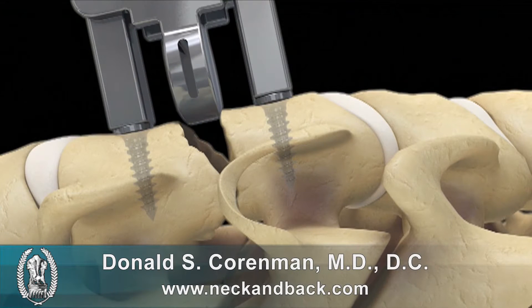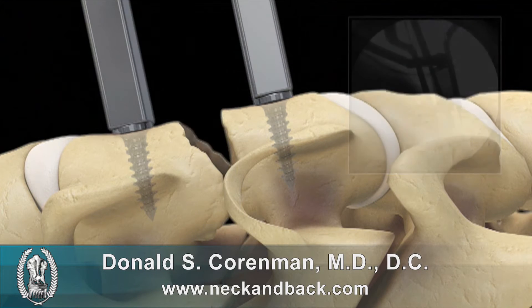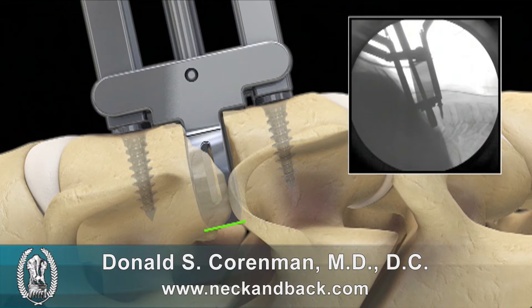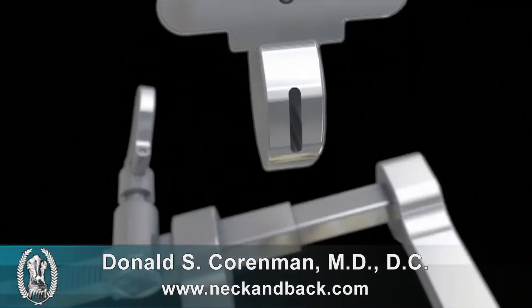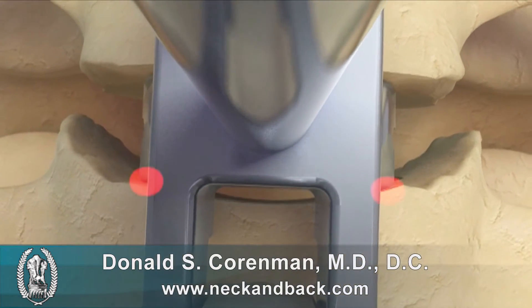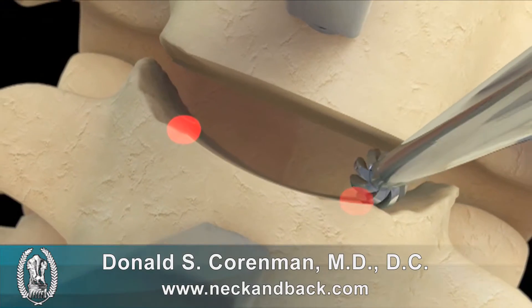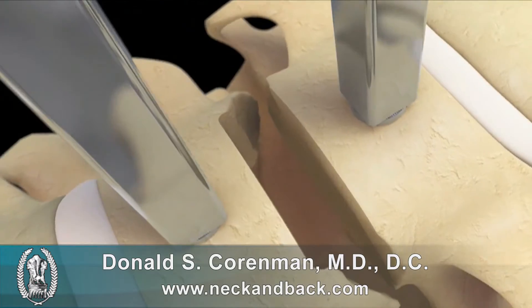Then you have to have a trial to determine the correct size of the end plate. Here, with the red marks, you'll see the trial does not fit all the way to the back of the disc. This device here does, with the green line indicating the back part of the disc space. This trial is then placed in and the surfaces that accept it have to be parallel. If you look down here with the red marks, you'll see that there's still a curve of the disc space and further work has to be done to accept a perfectly parallel trial.